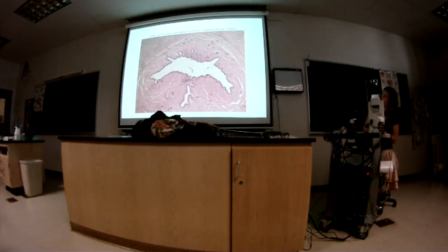There's the corpus spongiosum surrounding. Here's the, what's this again? The spongy urethra, yeah, and you can see part of the collagenous sheath right up here. The difference in the tissue: all the fibers versus the smooth muscle and elastic mix.